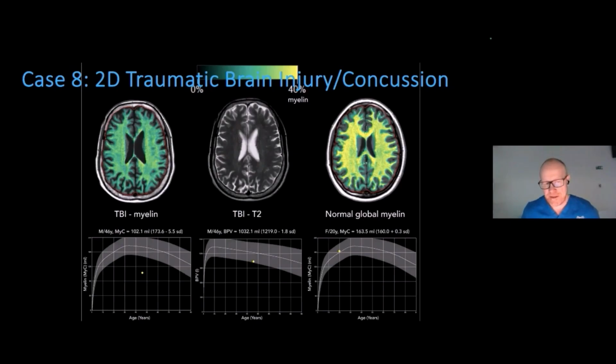And they fatigue very easily, and looking at traditional ways of quantitative MRI, they can be quite lengthy. To be able to do a 2 or 3 minute scan on someone who's had a traumatic brain injury and actually have quantitative data spit out immediately, I think if you can use this to grade and basically be able to make assessments of changes that you can't see with routine imaging, this is really going to impact the treatment of patients early on, which is very important.